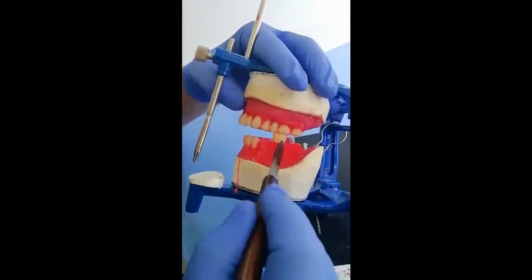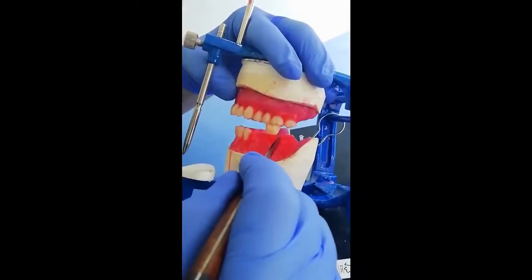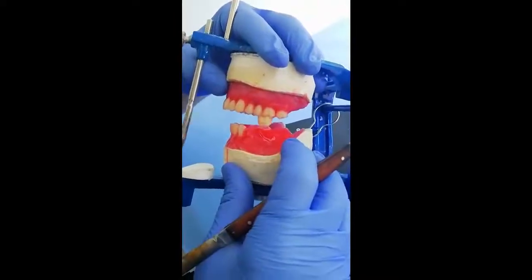Now we close the articulator and observe where we are going to open space for the mandibular molar to be accommodated in the wax.